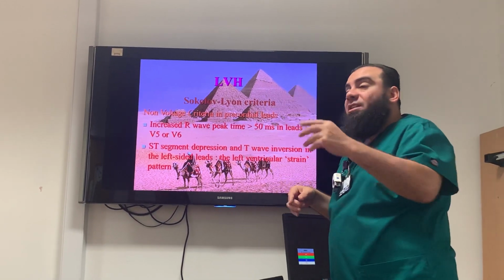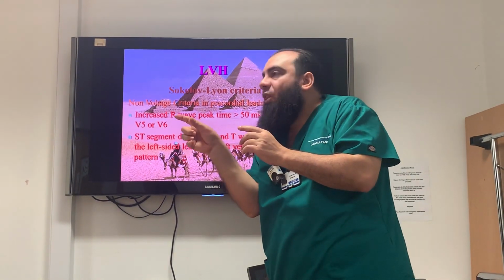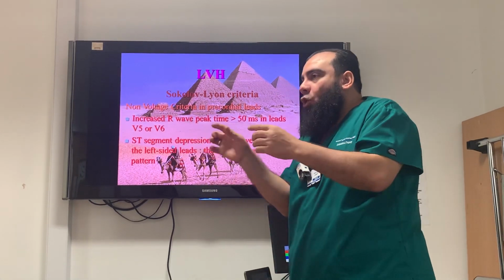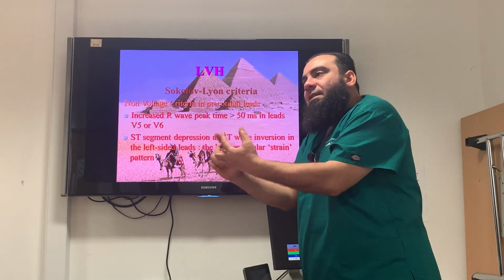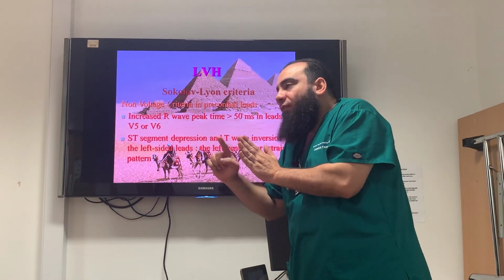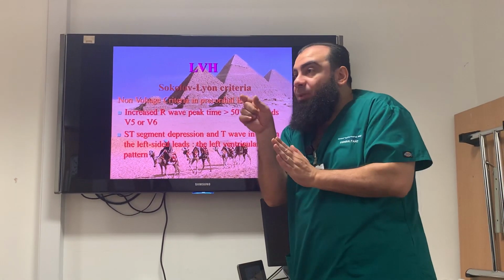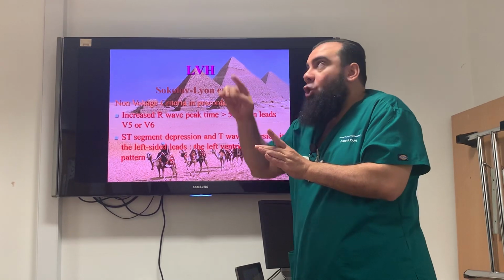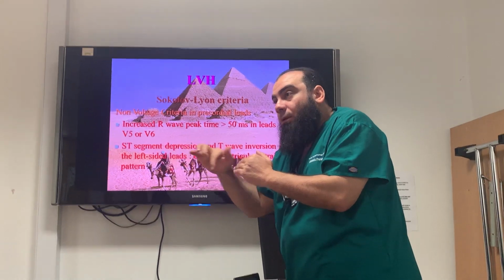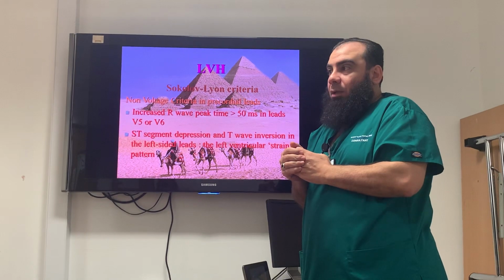What it represents, to understand, is actually the excitation across the whole thickness of the ventricle. Because this ventricle is hypertrophied, it is thick enough that the wave takes time to travel across that wall. Do you understand it? This peak time, from the end of the PR segment to the peak of the R wave, represents the timing of crossing this thickness. So it can represent the hypertrophy. Is it okay?